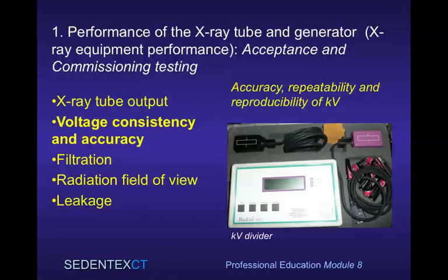The accuracy, repeatability, and reproducibility of kilovoltage is also assessed as part of acceptance and commissioning testing. This is the piece of equipment that might be used for this purpose. Again, this equipment would never be readily available to a dentist, so the involvement of a medical physics expert is essential.